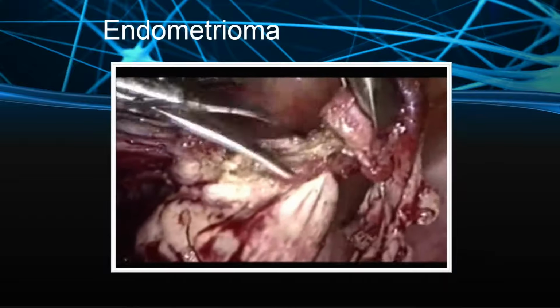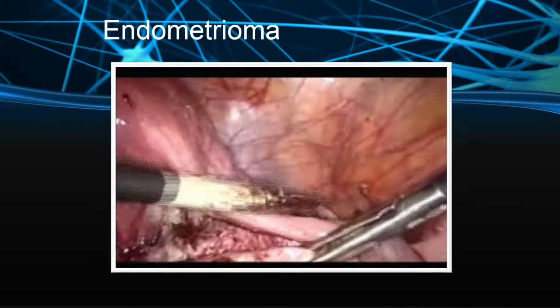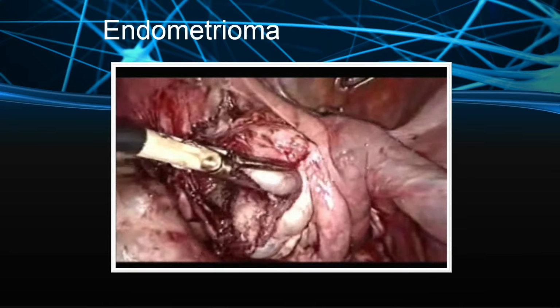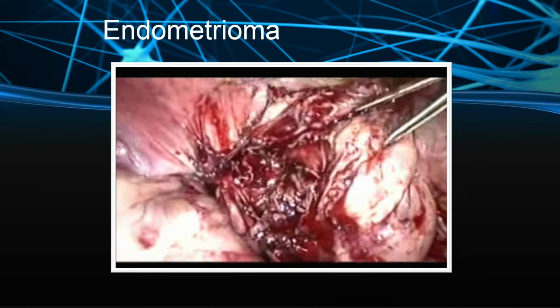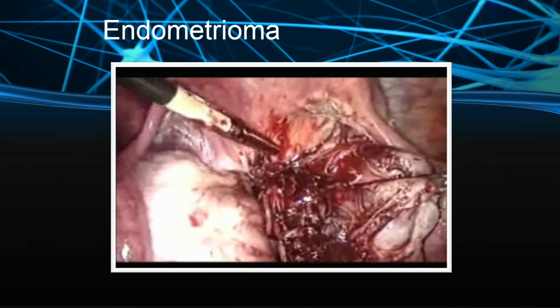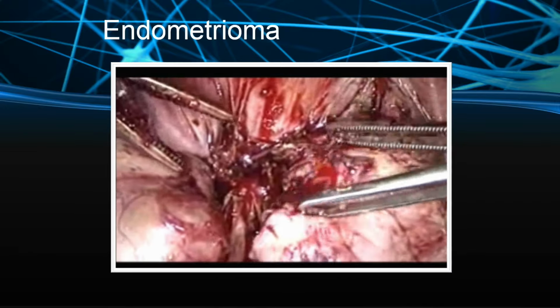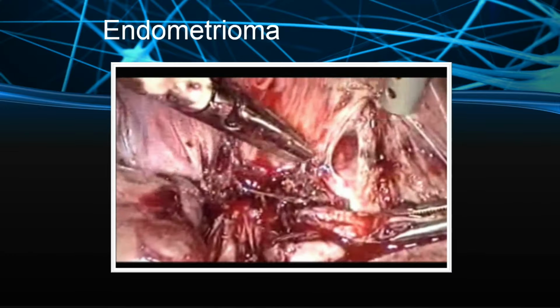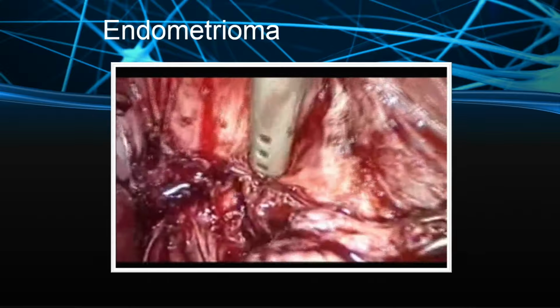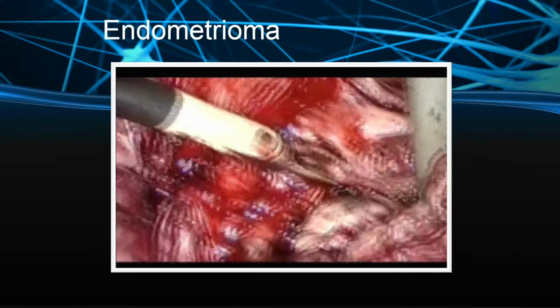Then you cut it out and keep it in the anterior cul-de-sac, collected there, so that at the end you can put all these pieces piecemeal in the endo bag. So, you have to take the ovary out in small pieces, and generally risk versus benefit has to be weighed. Sometimes if you are too aggressive, postoperatively complete ovarian failure will occur, and if you are a little reluctant, then there will be no benefit, and next time there will be very bad endometriosis.